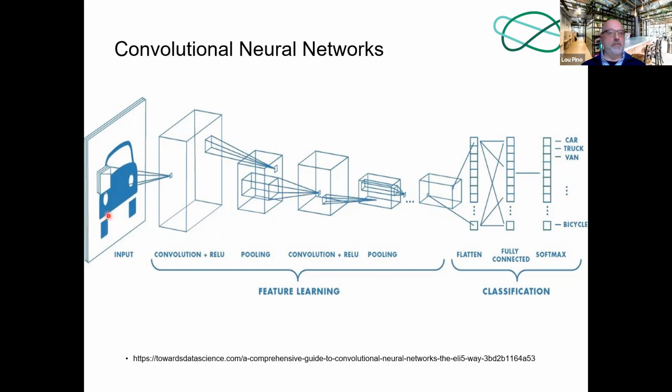The raw images get filtered by convolution and pooled to create a set of features that is smaller than the original image. So again, notice how pooling shrinks the size of the feature matrices. On the next layer in the convolutional neural network, again, the features get filtered and shrunken again by pooling.